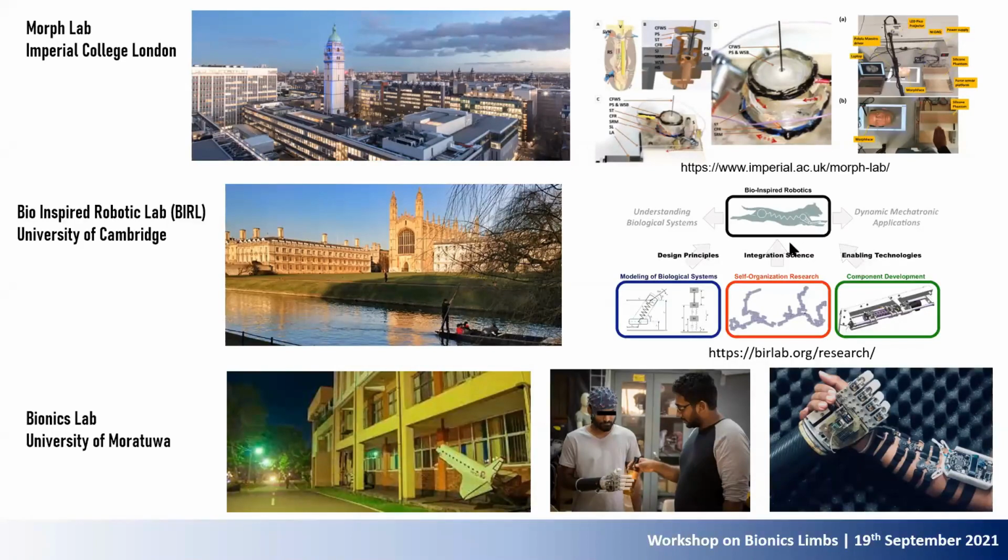This includes, for example, soft robotic-based prostheses, because we have seen a lot of prostheses and bionic devices from this morning, the previous presentation by Dr. Sanjay, and yesterday as well. But most of these existing prostheses are rigid prostheses.